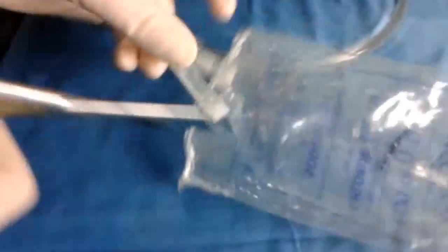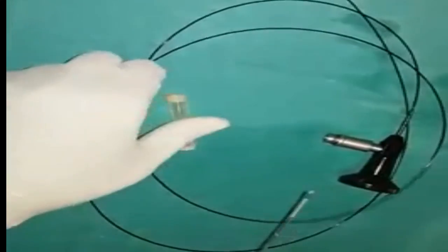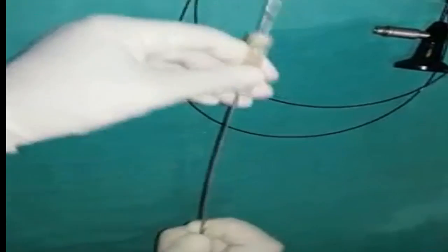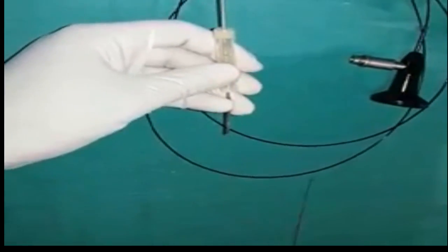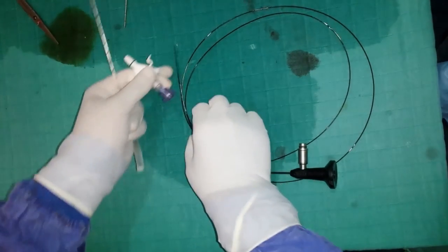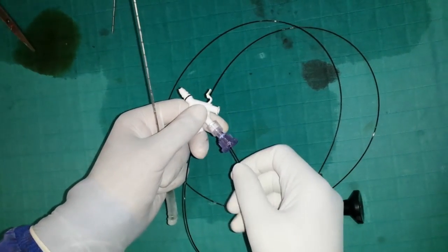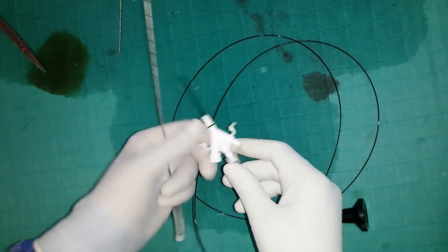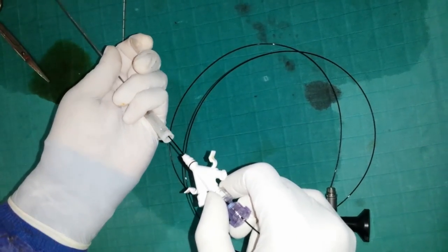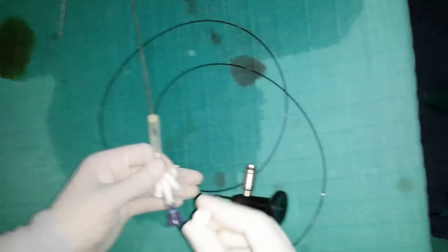The injection port of a serum bag is harvested. The 16 gauge needle is inserted through the injection port from the inside. The visualization fiber is inserted through the three-way adapter and inserted into the needle. The three-way adapter is fitted snugly into the injection port.